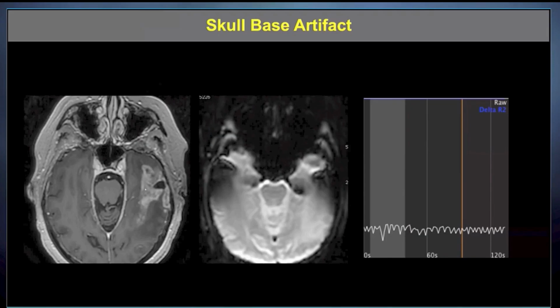If you have an enhancing mass in the low temporal lobes, you can see on the source images how much susceptibility artifact is here, and you can also see a lot of the air resulting in a lot of this dark signal. And if you look at the signal intensity time changes, you didn't really register any. So it's really important to take a look at the source images and scroll through the images and see if the patient moved or if the patient's lesion is very low in the skull base. That can be particularly a problem.